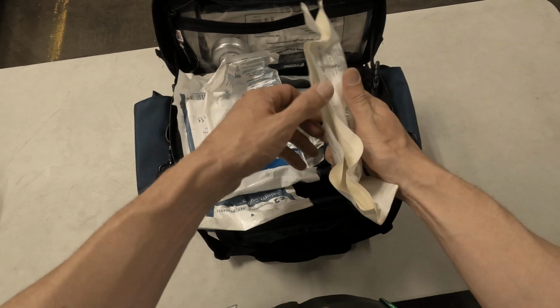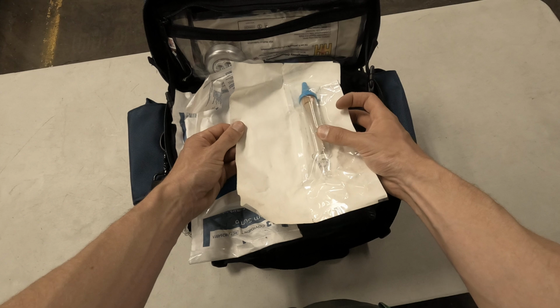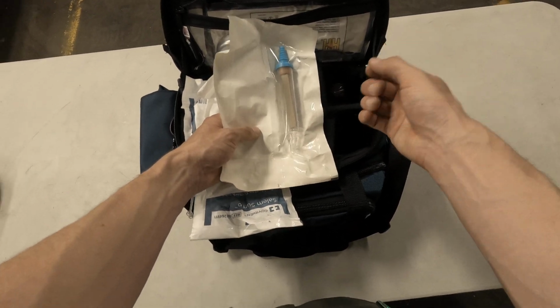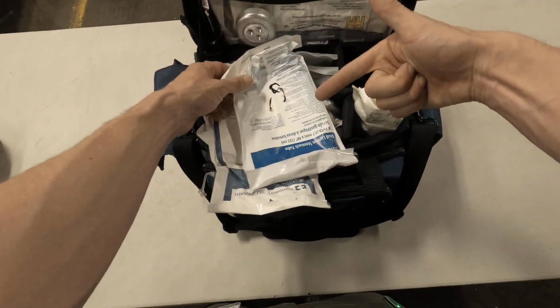This is a chest drain with a little butterfly valve on there. So if you do a chest tube, or if you want to needle somebody's chest, you can use this, and that way you know that air is coming out and not going in.